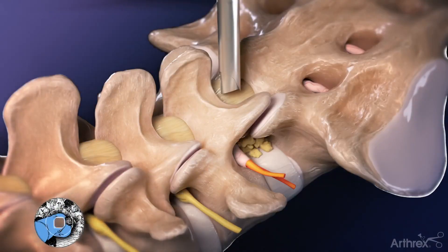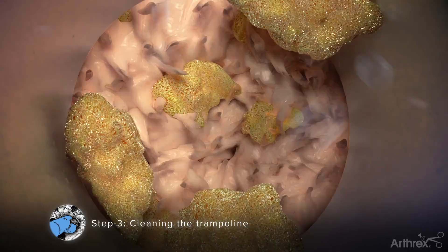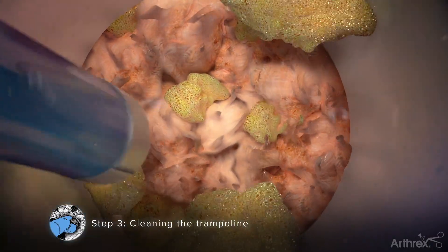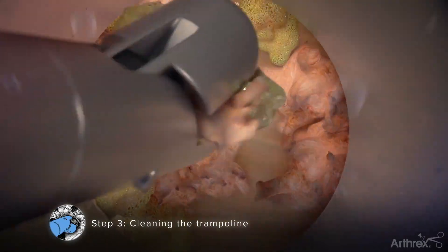Step 3: Cleaning the Trampoline. Once the endoscope has been inserted, insert a series of grasping instruments and the electrosurgery probe through the working channel of the endoscope to remove excess tissue and coagulate blood vessels to expose the ligamentum flavum.